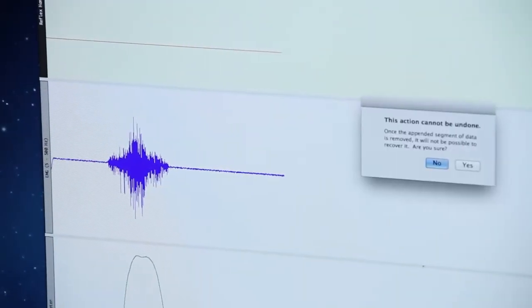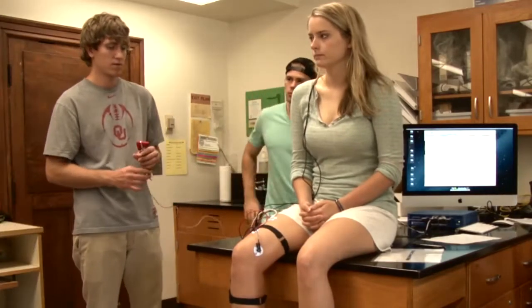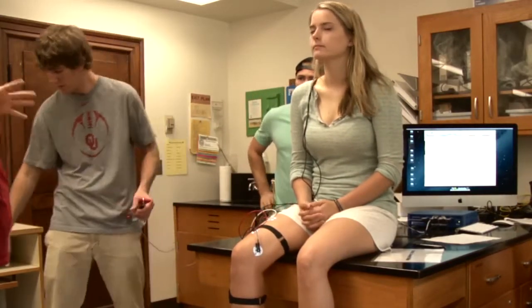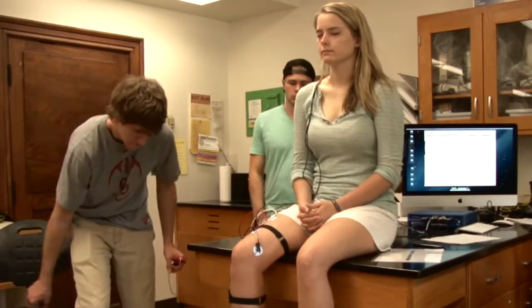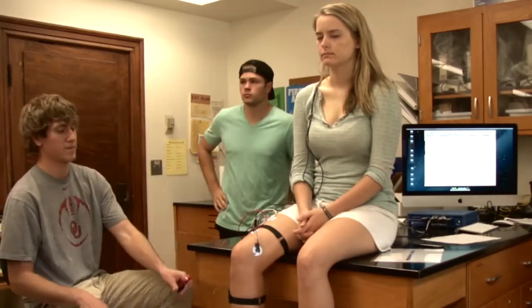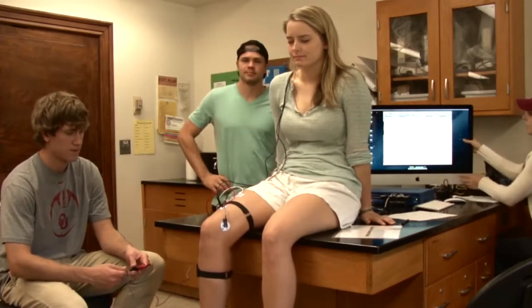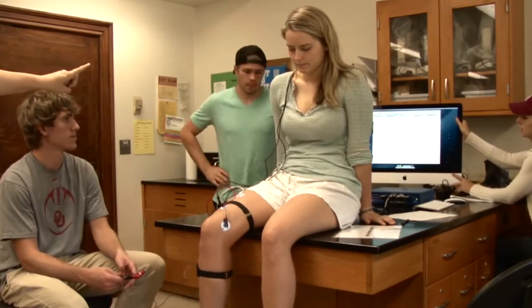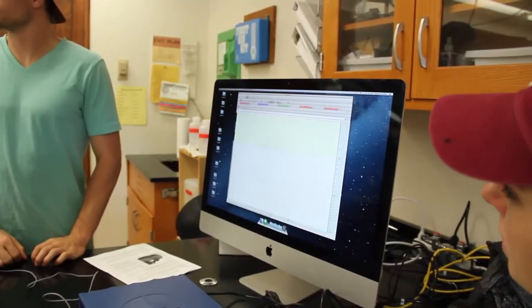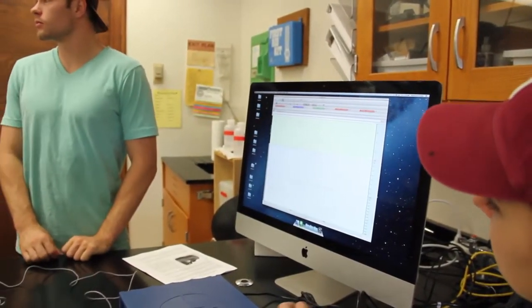Go ahead and stop that and use the rewind icon to delete that data because we don't need it. For this part, we have to get coordinated. We're going to have our subject close her eyes because we want her to be completely relaxed and unaware of what's going on. When we're ready, the computer operator clicks start and needs to be able to see the screen. Can you point to which channel is the goniometer?